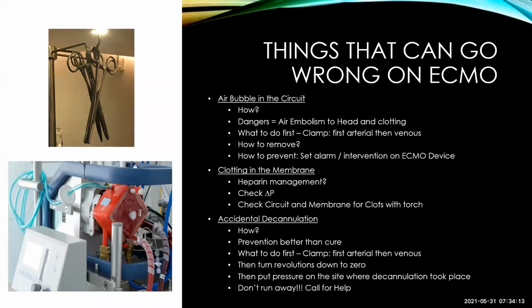And accidental decannulation most often happens when your patient's almost ready to come off ECMO, and they actually look normal, because now they're extubated, they are sitting in the chairs, they're eating normally, they're talking, they're actually fine, and you think that you can leave them alone, but you still can't leave them alone, because there's still 3 to 4 liters running through the circuit per minute. So if they move around, or say for instance your sutures became a little bit loose over time, then this thing can easily pull out.